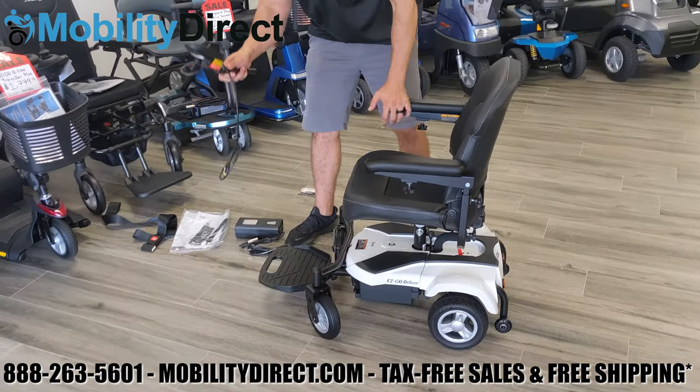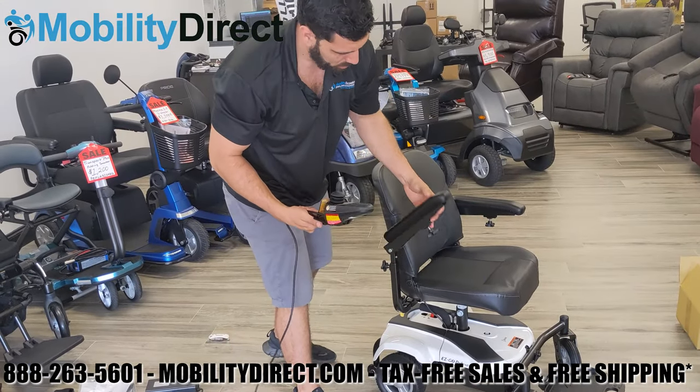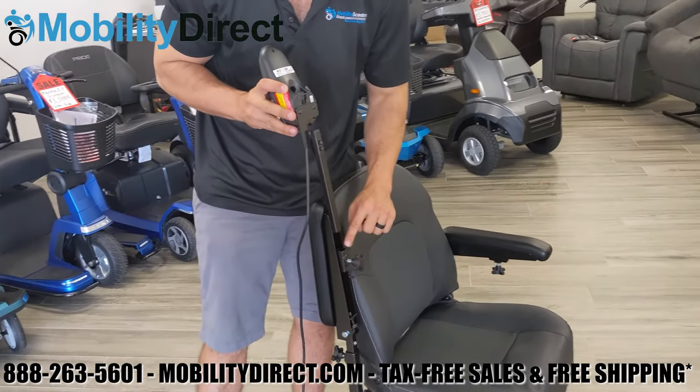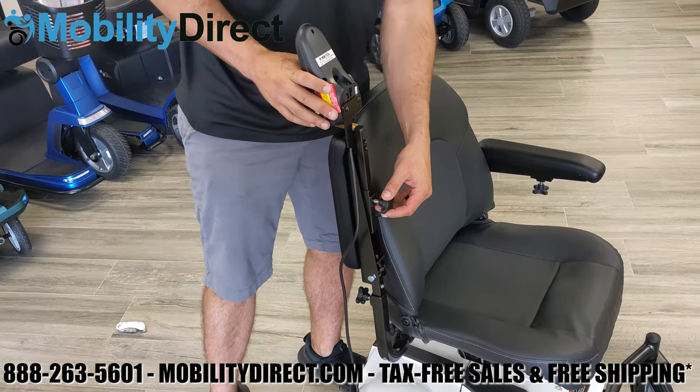We're going to use the right-handed armrest, but you can do it on the left as well. Each armrest comes with a tension adjustment knob and a bracket for the joystick. Go ahead and slide the joystick rail into the sleeve and tighten the tension adjustment knob.